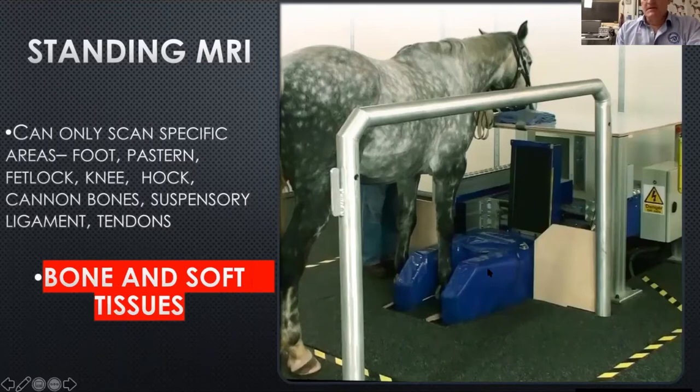It's pretty simple — big magnet hooked up to a big computer up the front of the room. We only have two people in the MRI room: one holding and administering the sedative as needed, and the veterinarian up the front running the computer. The big difference between the standing MRI and the scintigraphy unit is you have to be really specific about what you want to look at, because we can only scan certain regions one at a time.